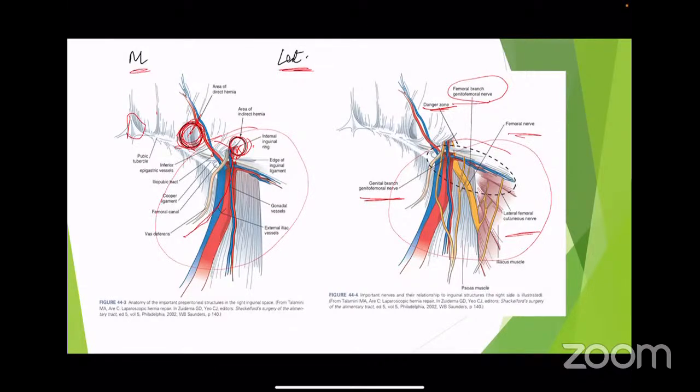It will create severe pain, or it can bleed like anything during the intraoperative or post-operative period, and the patient can become critical while operating. So we have to take care of these two areas. We have the triangle of doom and the triangle of pain. I'll discuss it later on.